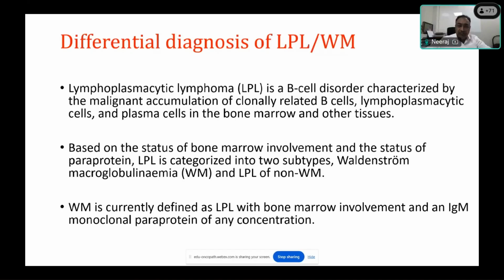In rare subtypes, there could be IgM myeloma, which overlaps with these parameters, and with the IHC more or less similar, because the IgM myelomas are cyclin D1 positive. They express translocation 11;14, and they are also CD20 positive.